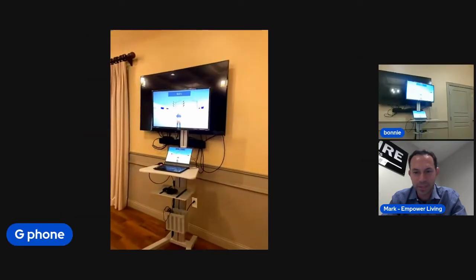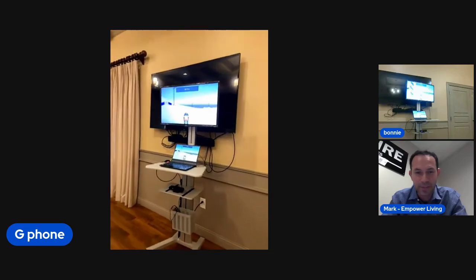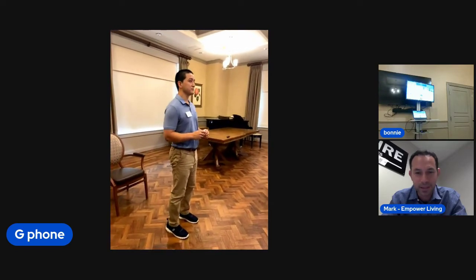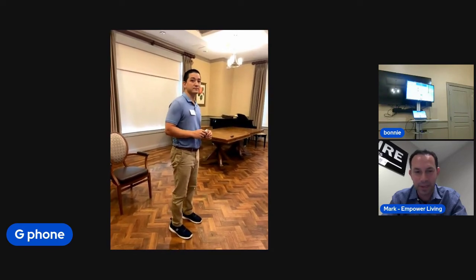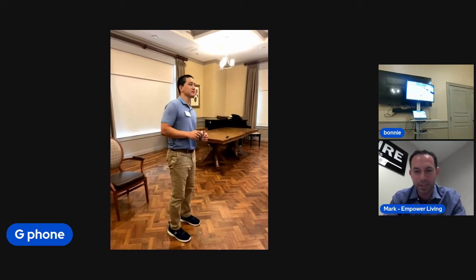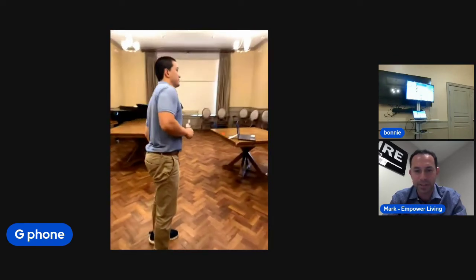Okay, let me switch here so you can see it better. There we go. So video games aren't just for kids anymore. They're much more interactive these days. The difference between this and the Nintendo Wii that I remember, I haven't used it in several years. With the Wii, you have controllers that you're holding, and so the screen is using the controllers to kind of dictate your movements. In this case, it is picking up your actual body parts.